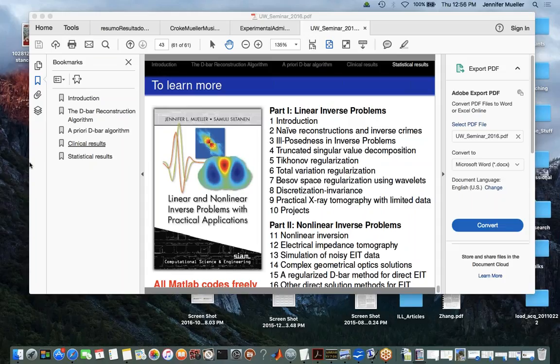Okay. And we found that by frame is actually faster than by pixel because of the setup time for certain functions. So I can tell you the time. It's harder to say per pixel, and per pixel would be tiny. To do one frame, it depends, but we had 0.0625 seconds, I think. Real time, if you're going at, I think it's 24 frames a second, but I'm not sure if it's 24 or 30. I'd have to calculate that again.